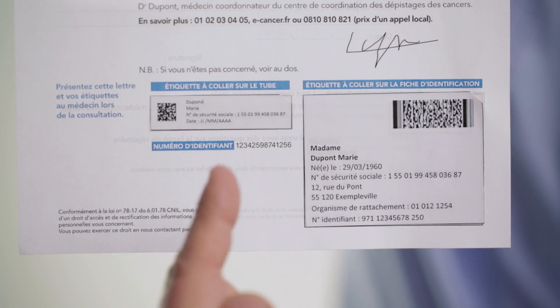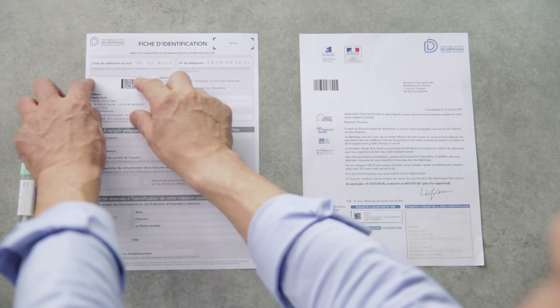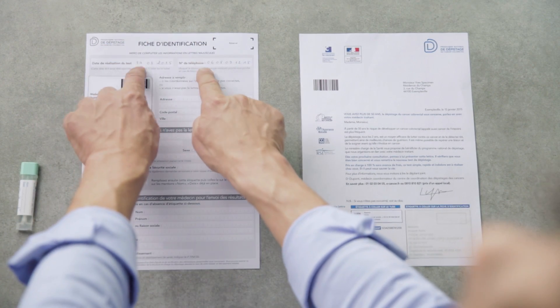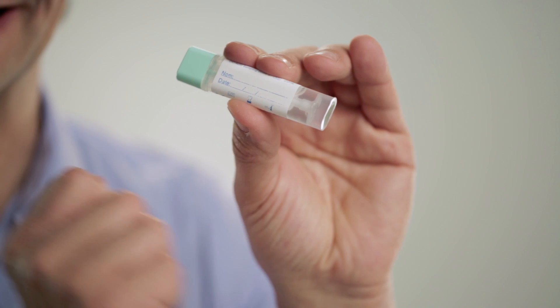First, you must identify yourself using the letter sent to you. The letter has two labels: one large, one small. The large label has been printed with your details — stick it on the top left of the identification form, remembering to complete the information. The small label, on which you must record the date you do the test, should be stuck on the tube where name and date appear.